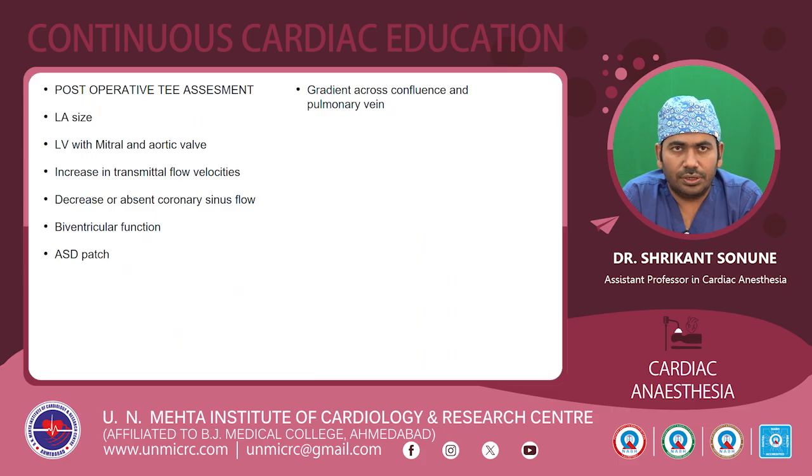So coming to the postoperative TEE assessment, we have to look for the size of the left atrium after the repair of TAPVC, and the size of the left ventricle and the mitral as well as the aortic valves. There will be an increase in the transmitral flow velocities as the ASD patch has been closed at this time, and we have to make sure that there is a decrease in the coronary sinus blood flow, or the coronary sinus flow cannot be appreciated after the TAPVC repair.